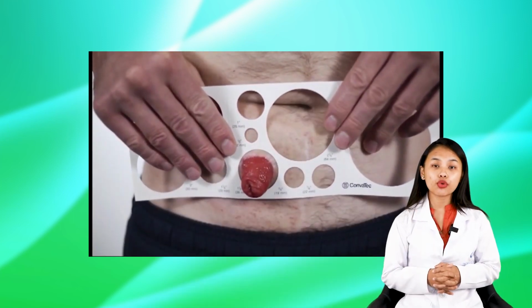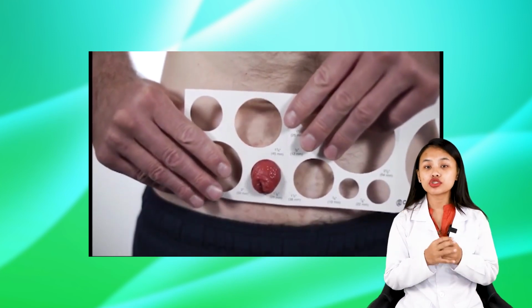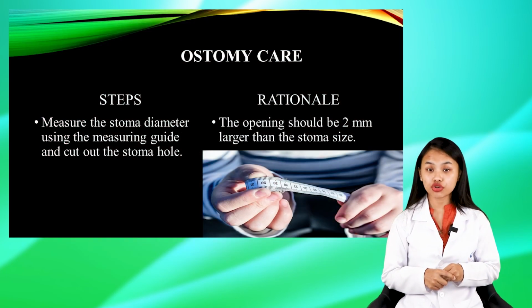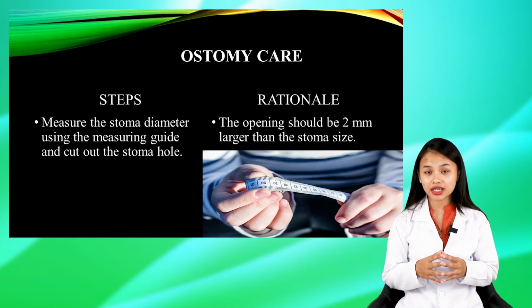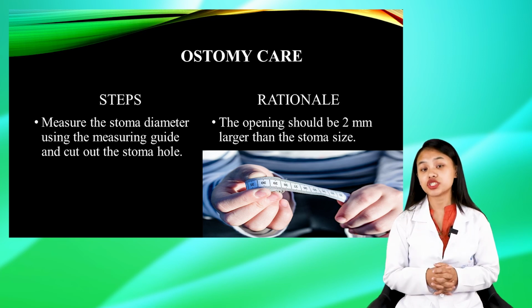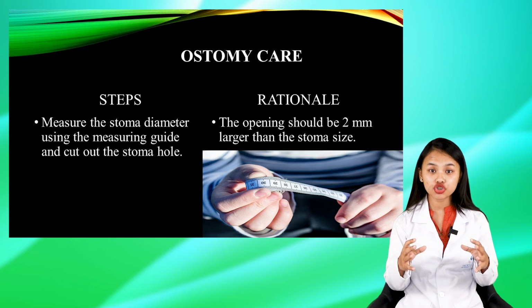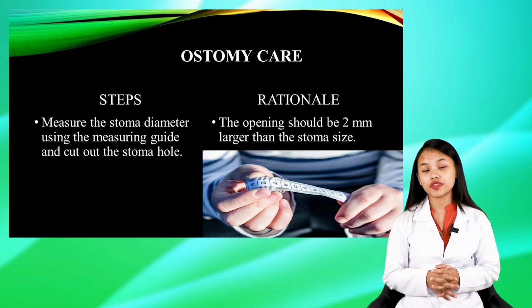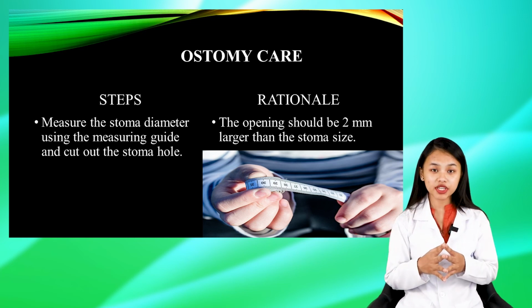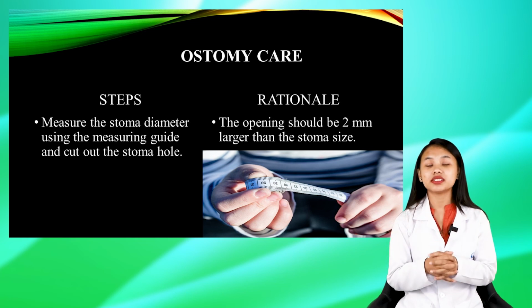You must also measure the stoma diameter by using the measuring guide, and also you must cut the stoma hole. You must trace the diameter of the measuring guide onto the flange and cut on the outside of the pen marking. So here normally the opening must be 2 mm larger than the stoma size.